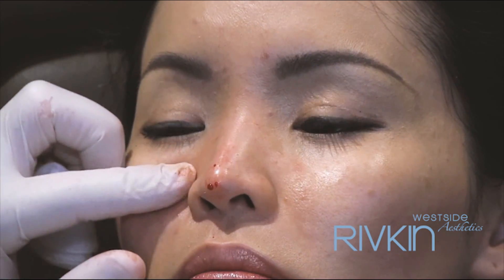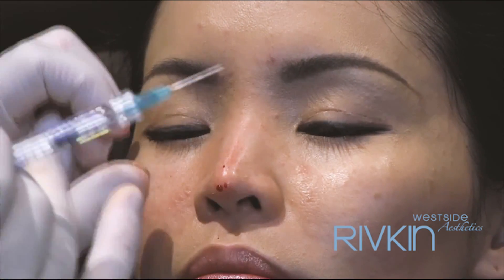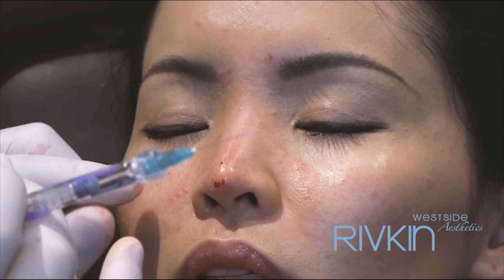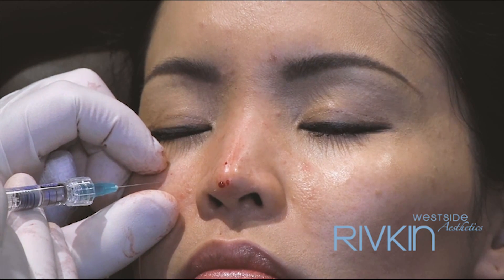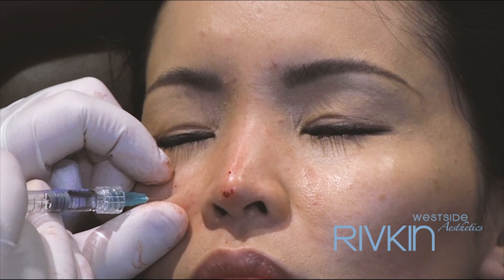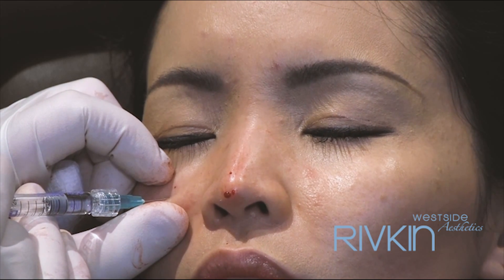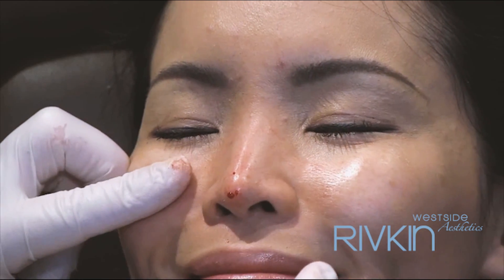And again there's an opportunity to mold right afterwards so that things settle into the right place. Last one — I'm going to put a T, still a T in here. That's alright. Ok, good.